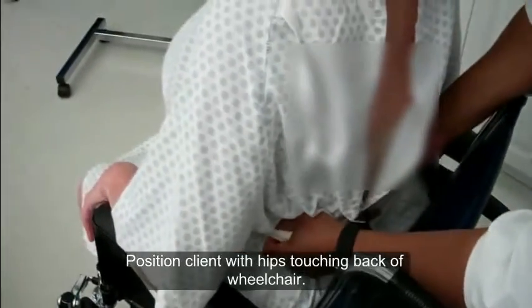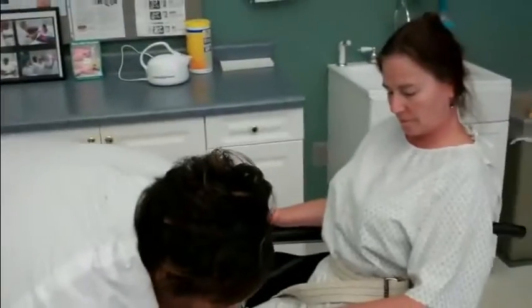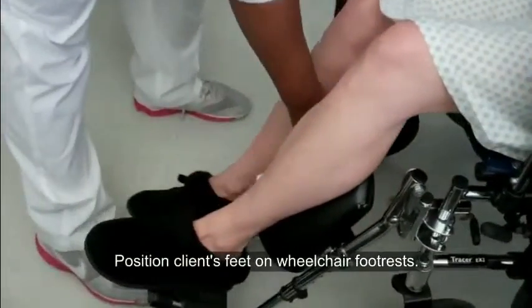I'm going to pull you back a little bit to get you more comfortable. One, two, three. Oh, that's good. Very good. Let's put your feet up. How's that? That's good. Very good.